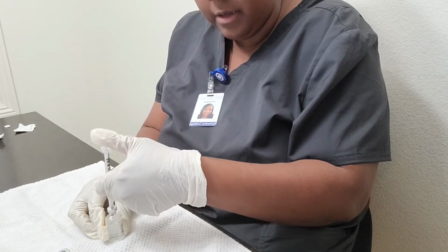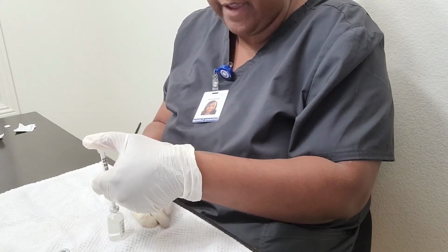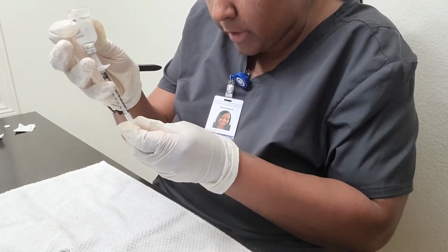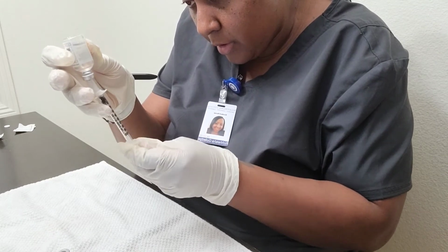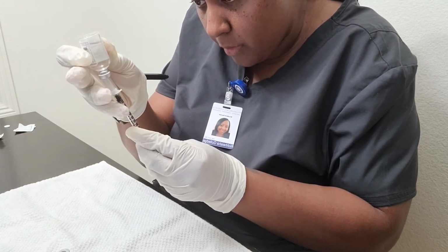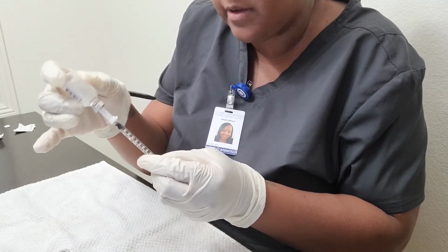And then I will release it, and I will not remove it. I will then invert it. And this is the regular insulin, so I'm going to pull back 4 units of regular insulin, 4 units.